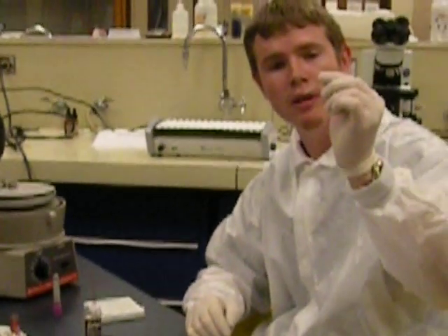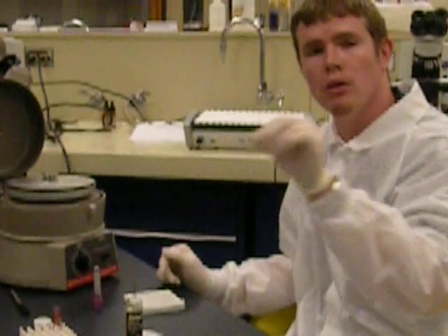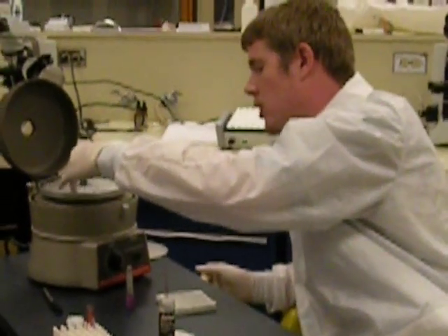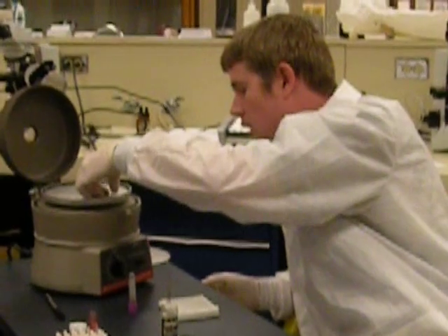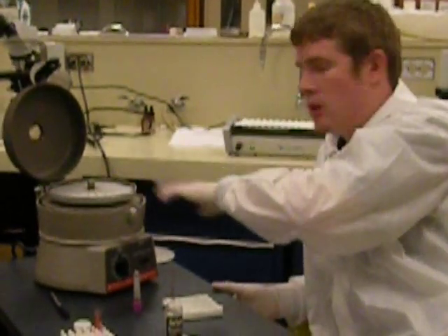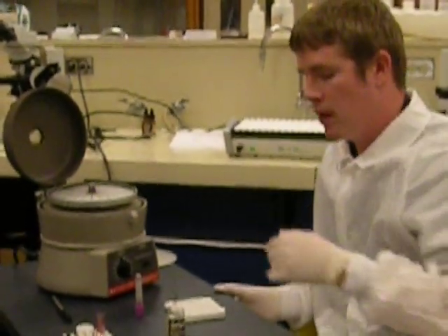Now that the capillary tube is sealed, you're going to run everything in duplicates. Go ahead and put this in the centrifuge — remember what spot you put it in. We're going to put this one in slot 15. Make sure that the clay sealer end is on the outside ring of the centrifuge, so that when it spins, the blood doesn't come out and make a mess.